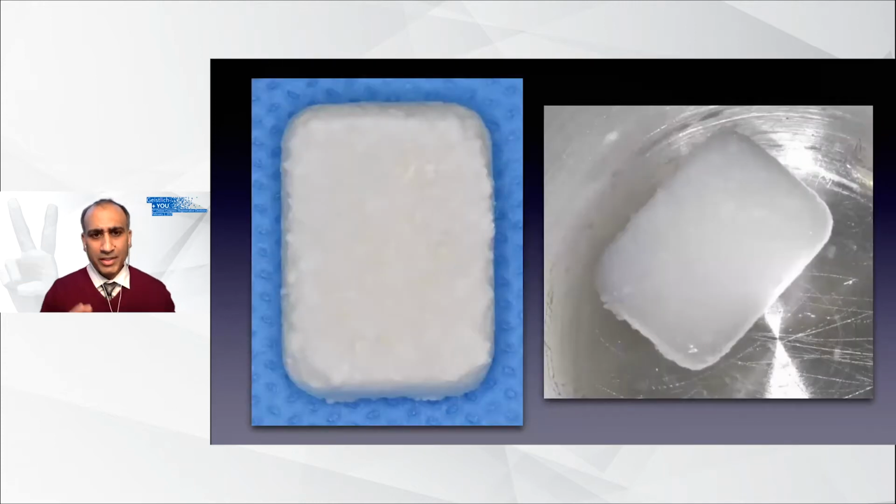On the left here, we can see our Fibro-Gide in its dry state. On the right, we can see it being hydrated in saline. Now, my rationale for hydrating this is because this, again, undergoes a 25 to 30% volumetric increase. So I want it at its maximal thickness before I put it into the site, because if it continues to expand after the patient goes home, I have a feeling that can lead to compromised healing. So we want to make sure we've gotten all the expansion out of the way first. I have made no attempt to trim this matrix in this particular case.